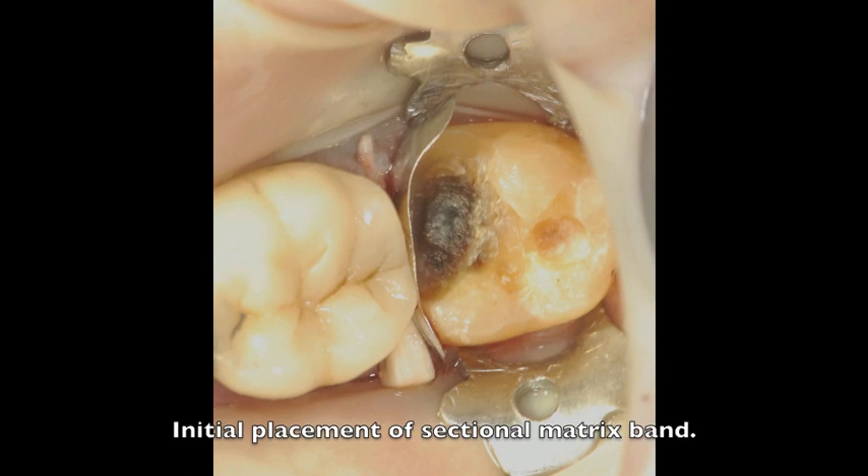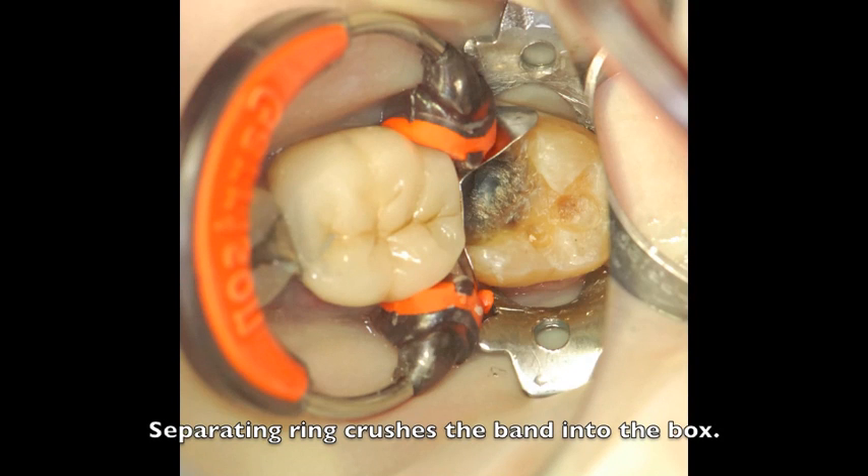After removing all the decay and completing the preparation, you can easily place a matrix band between the teeth. Now here is the challenging part. Once the matrix band is in place, when you place the separating ring on top of the tooth, you notice the pressure of the ring crushes the matrix band into the box, making it impossible to re-contour that band back to normal shape and contour.